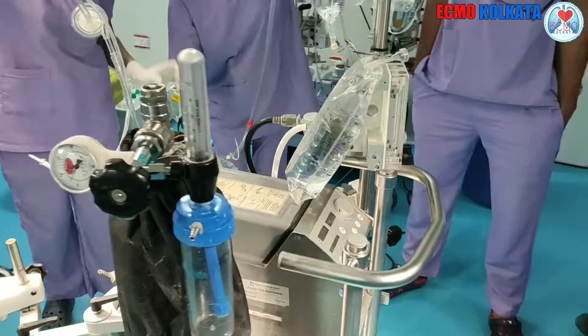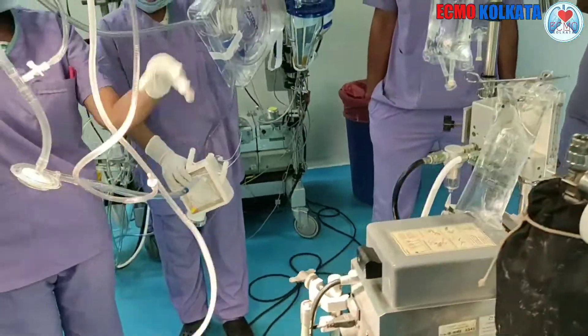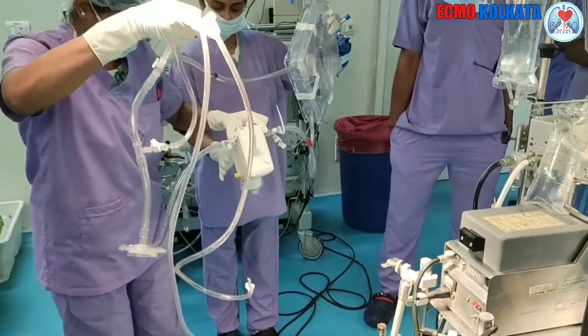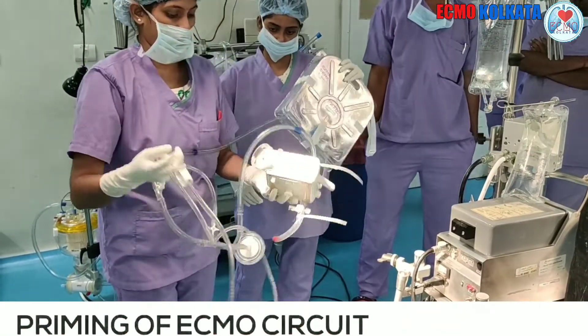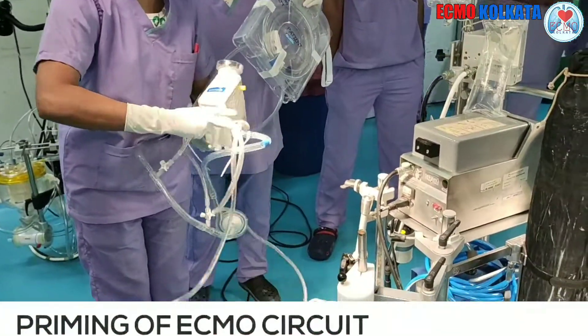Today we are going to learn how to prime the ECMO circuit. We are ready with our demo ECMO circuit for priming.